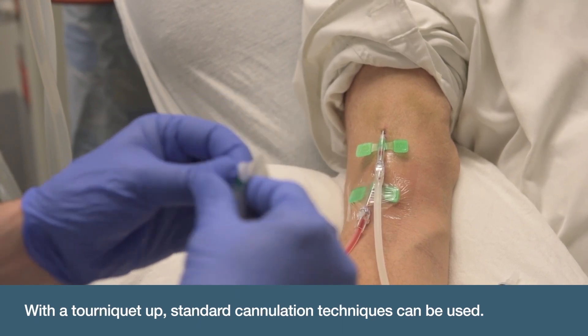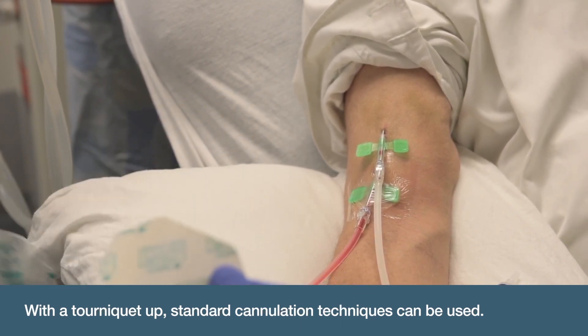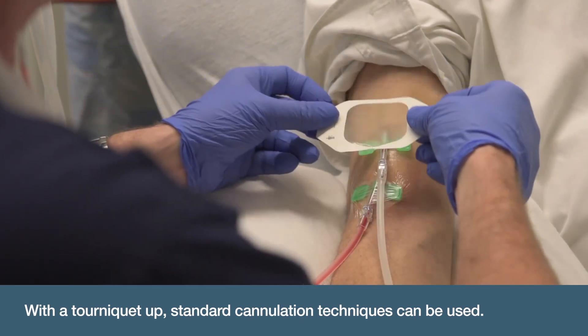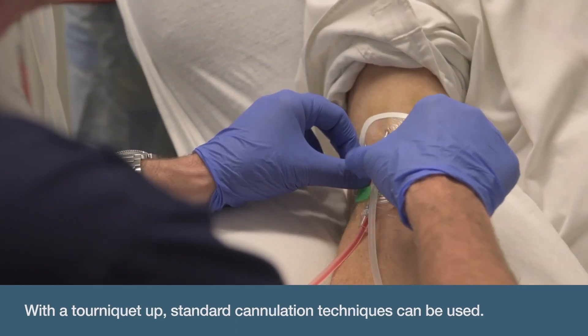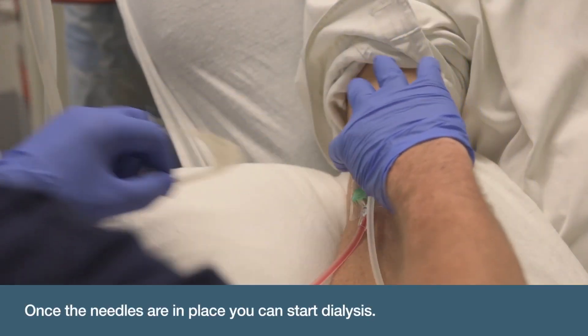With an endovascular fistula, there's really no difference in cannulation than with a regular surgical fistula. Once the needles are in place, you can start dialysis.